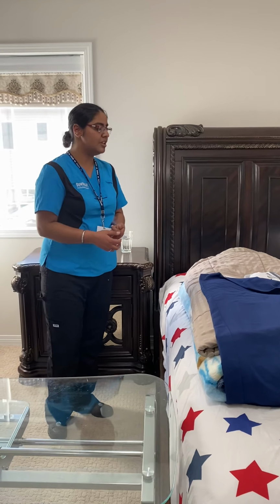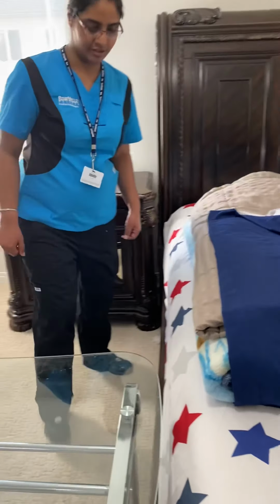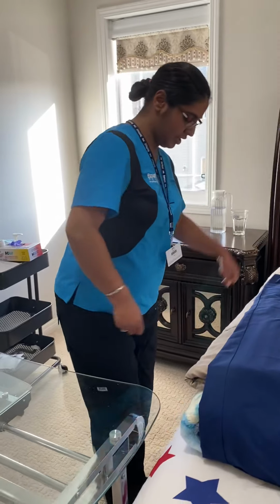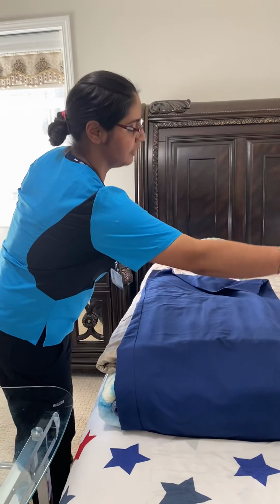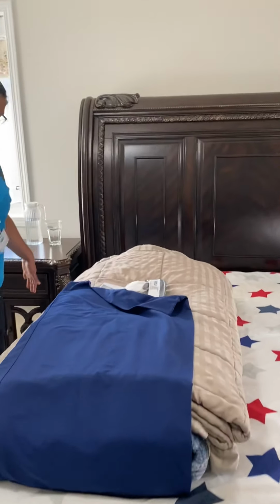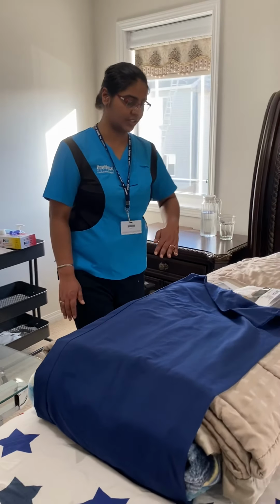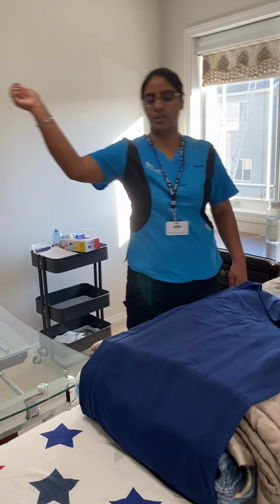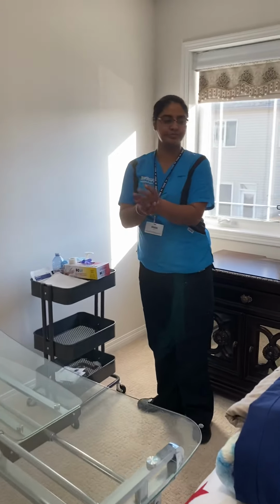Okay, thank you. So now I'm applying the brakes on all 4 sides of the bed, second, third and fourth. Now I'm putting the rails up on the opposite side of the patient, and I'm raising the bed to my waist level according to the sterile procedure, and the privacy curtains are on. Now again, hand hygiene for 30 seconds.